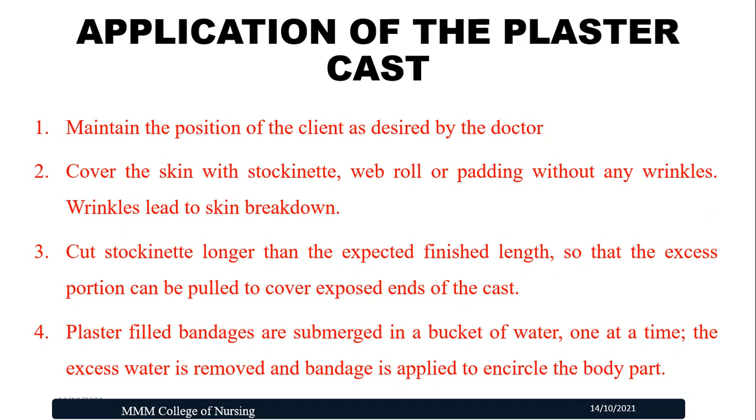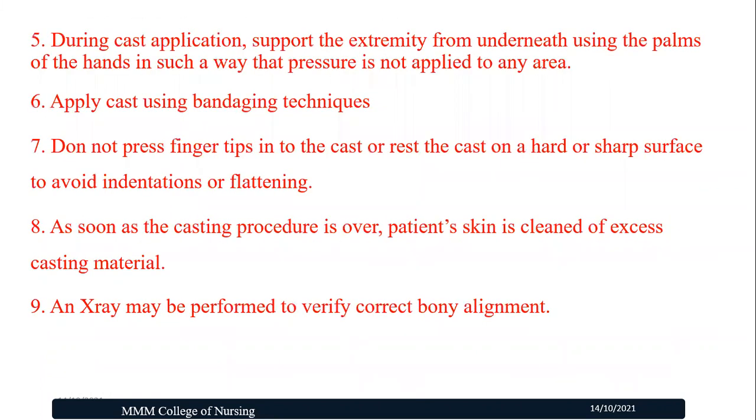Plaster filled bandages are submerged in a bucket of warm water one at a time. The excess water will be removed and the bandage is applied by encircling the body part. During cast application, support the extremity from underneath using the palms of the hands in such a way that pressure is not applied to any area.